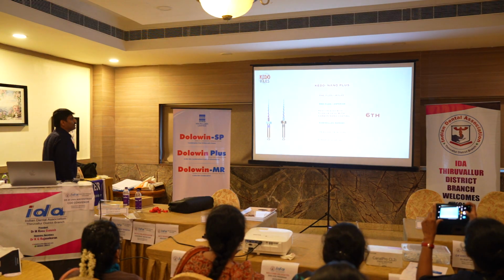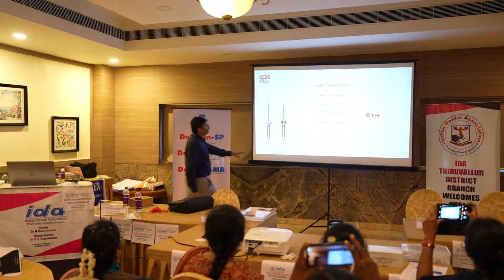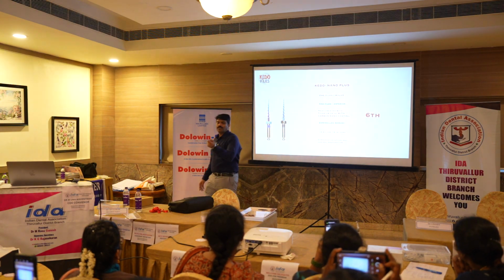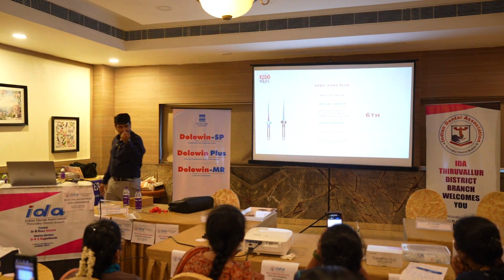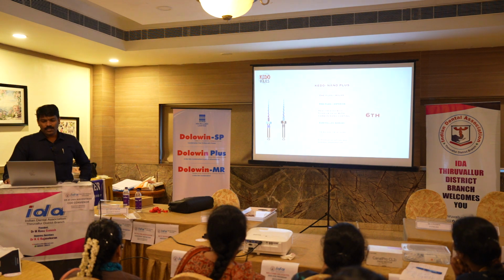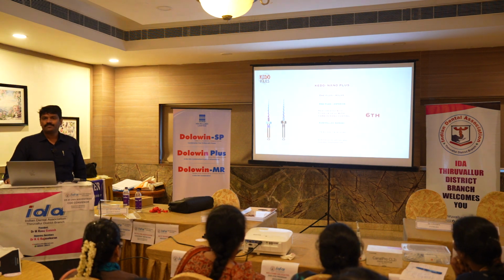Carbon nano coating plays a very important role. That's why I have made it little. Carbon nano coating is what actually keeps the file from fracturing that easily in this particular system. Conservative apical and coronal preparation.